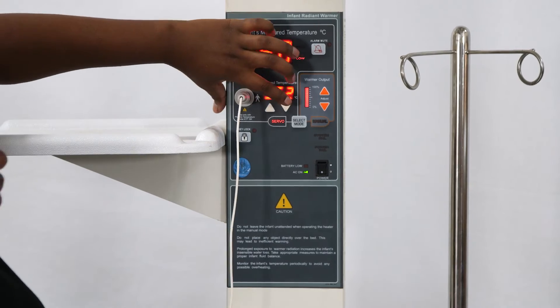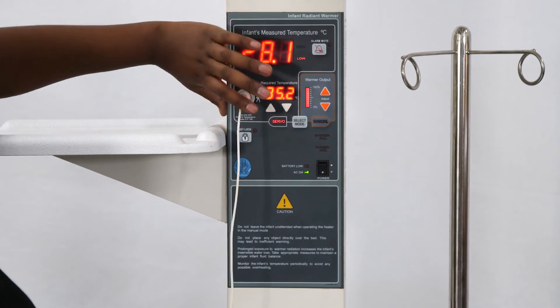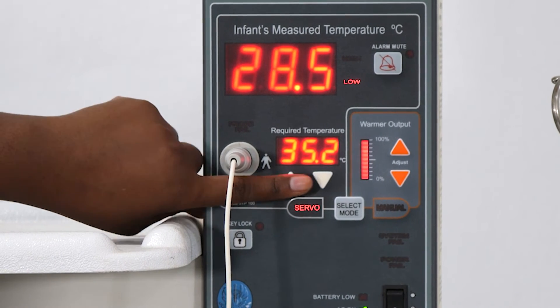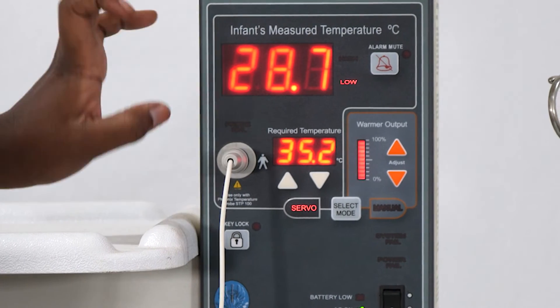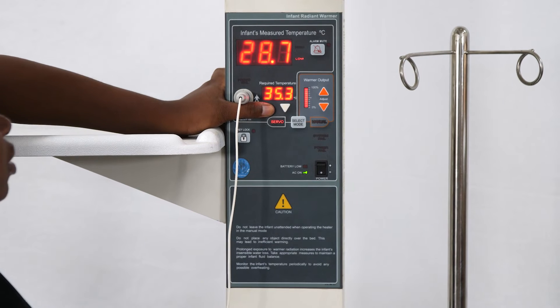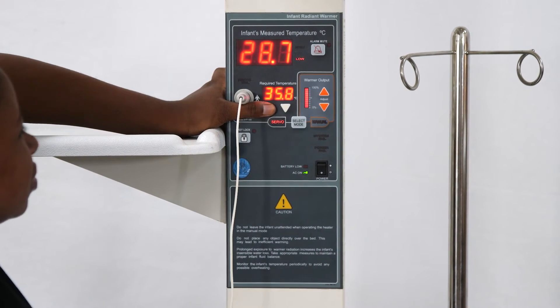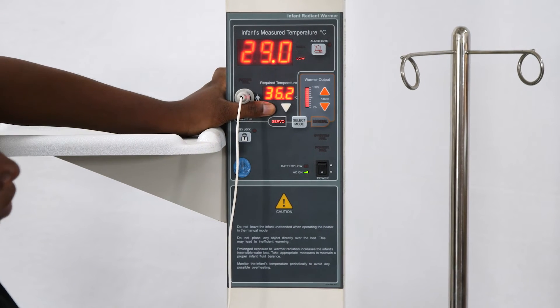In servo mode, the machine uses the readings from the probe to automatically maintain a constant temperature. The target temperature that you wish the machine to maintain is currently showing 35.2. The down arrow is for decreasing the temperature. You press the arrows immediately below to raise or lower it. It should normally be set at 36.5 degrees.